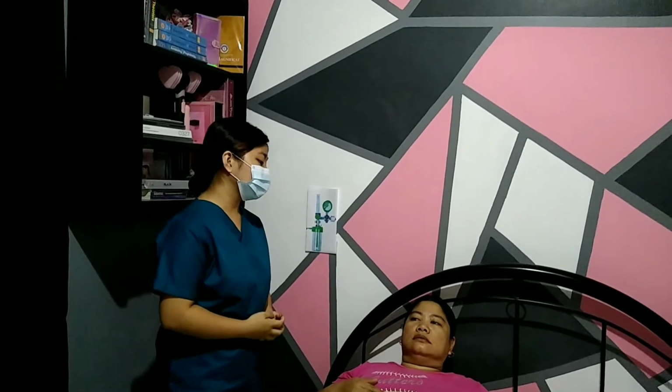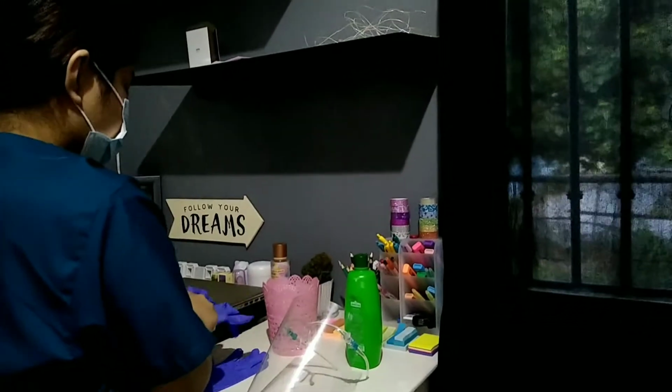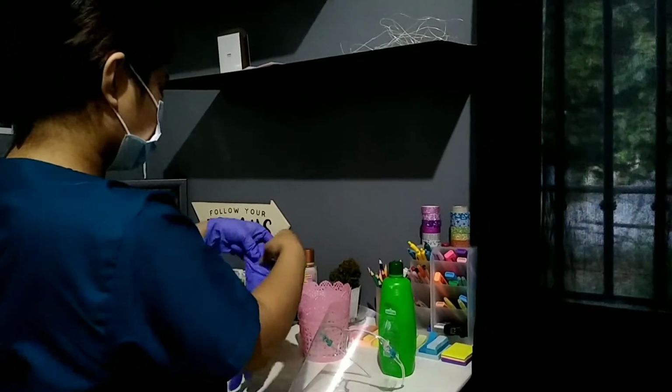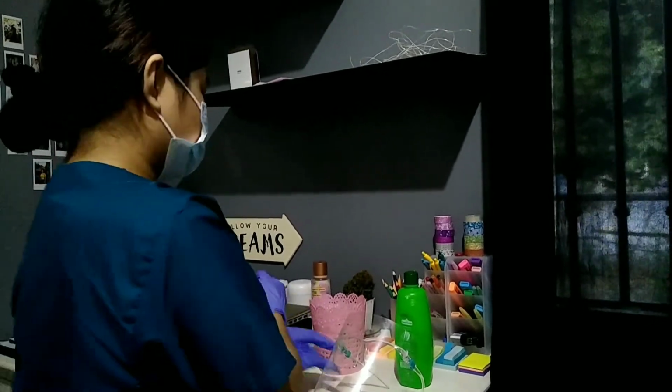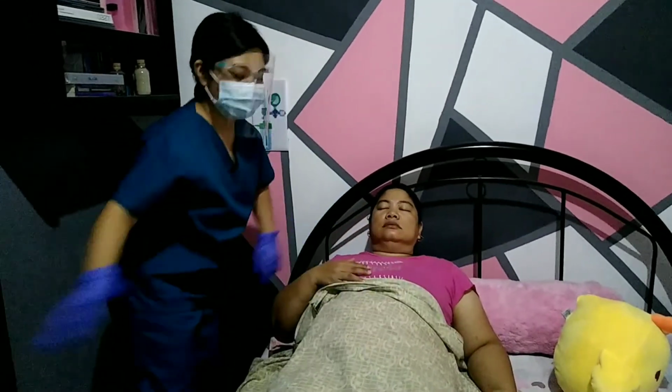Ma'am, please allow me to close the curtains for your privacy. Is it okay with you? Okay, thank you, ma'am. Close the curtains. And then perform hand hygiene. And then wear the clean gloves. Okay. And then wear also the face shield if indicated. And then after it, adjust the bed to appropriate height, lower side rails, and check locks on bed wheels.